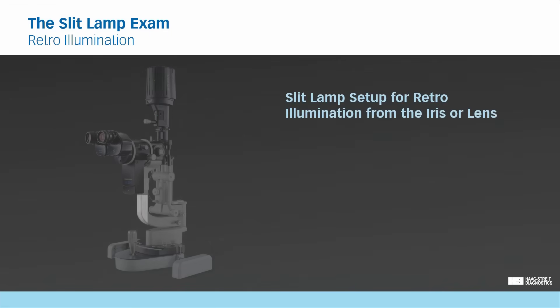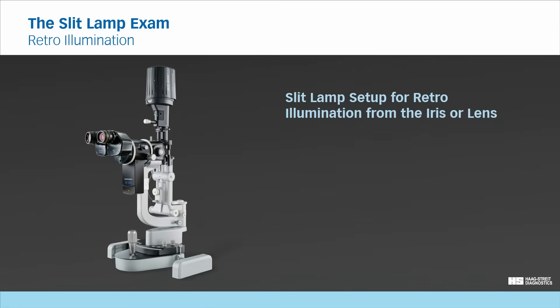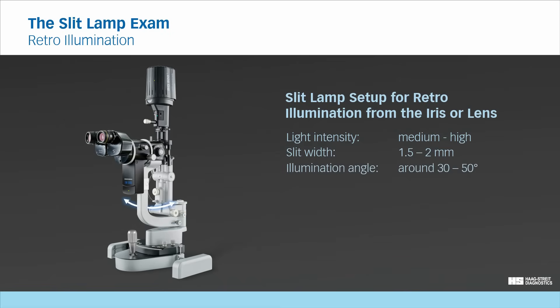To set up the slit lamp for examination with retroillumination from the iris or crystalline lens, choose a medium to high light intensity and a slit width between 1.5 and 2 mm. Set the illumination angle between 30 and 50 degrees. Choose a magnification of 10 times, or 16 to 40 times for higher detail. Initially start at low magnification and then augment as needed.